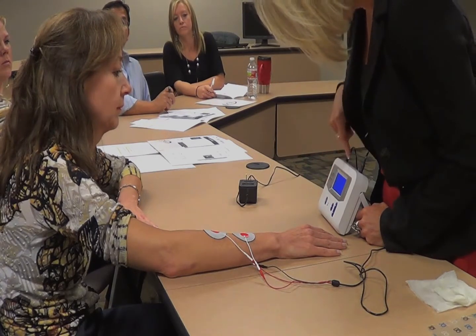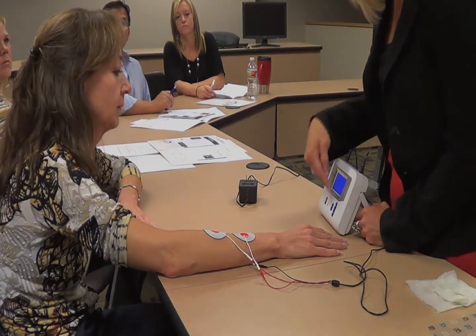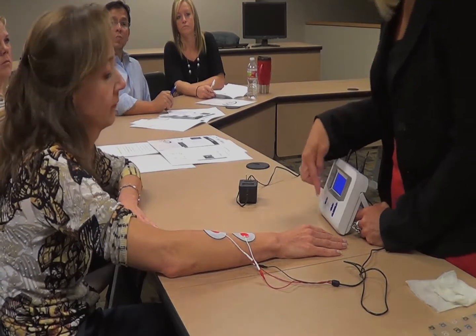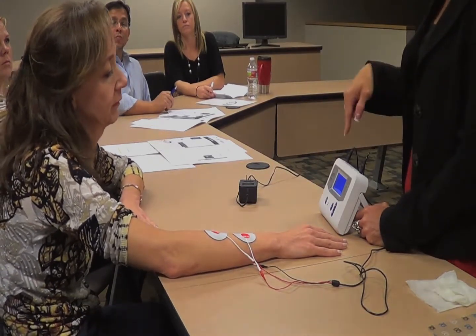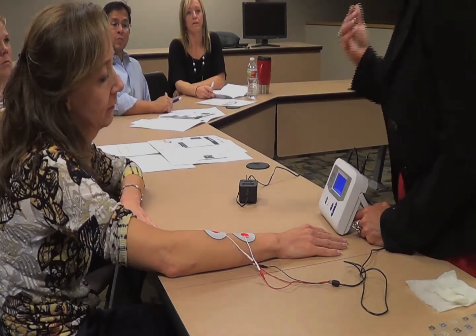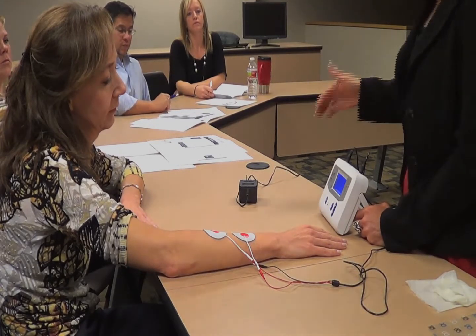So that first, when it's in program mode, if you hit it once, it'll go to threshold. That's where if you want to increase or decrease the threshold, you can do it here manually. Press program again, you're in the rest period. You can expand that to a longer rest period if you want. Like I said, if you just want the patient to rest longer even when it's in the ready mode, that's an option for you too.